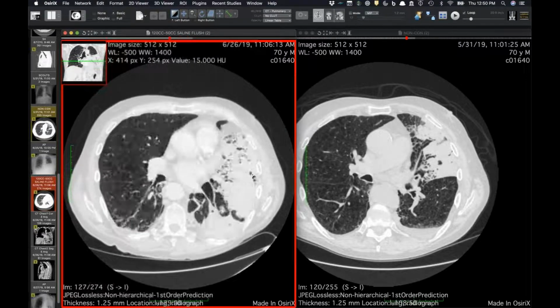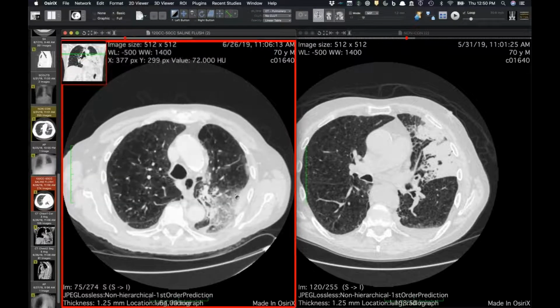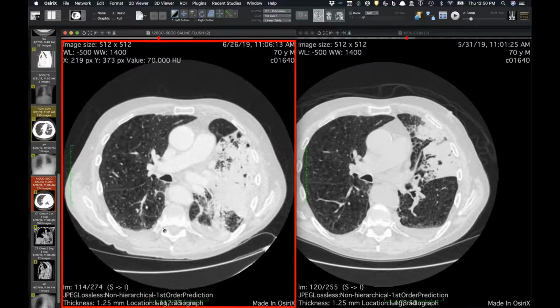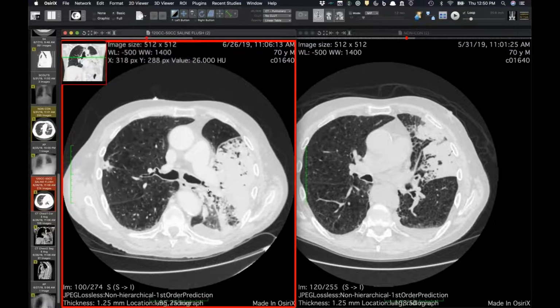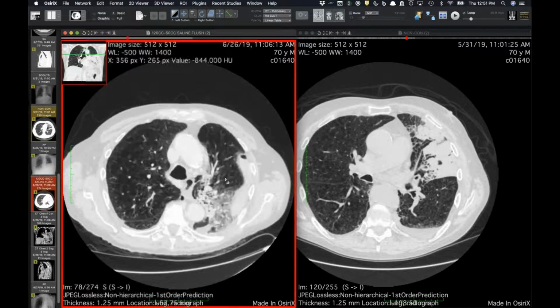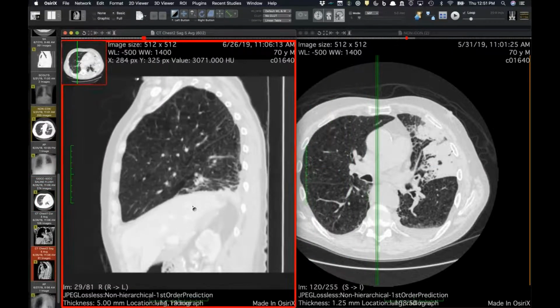I will show you a companion case, because I had only read and remember seeing Jeff show a case of what I suspected this to be, which is torsion from the pneumonia. And you can trace the airways here. This is the superior segment of the left lower lobe, which is now flipped up. And this is all portion of the left lower lobe that's coming anteriorly. So the major fissure has changed its orientation, and of course, explains why the radiograph looked the way it did.